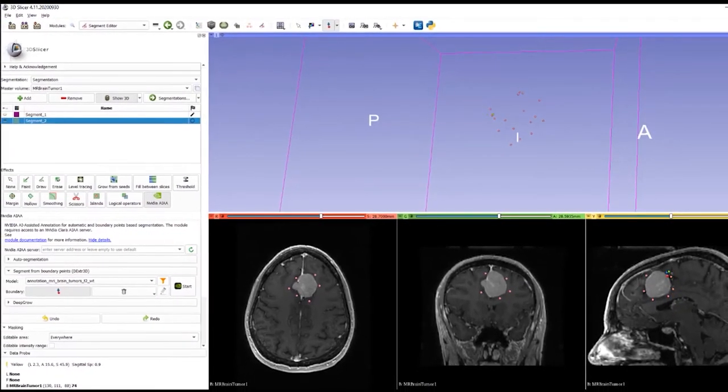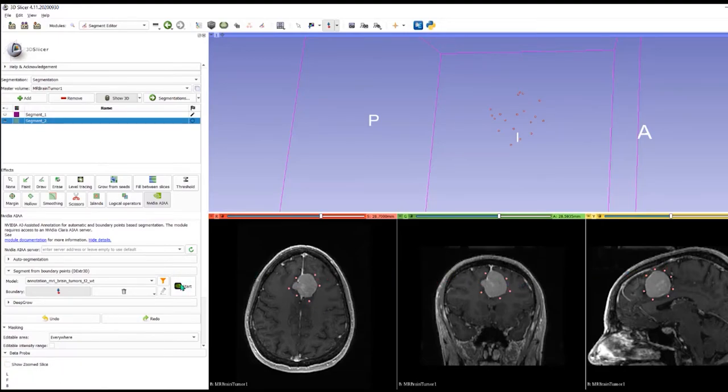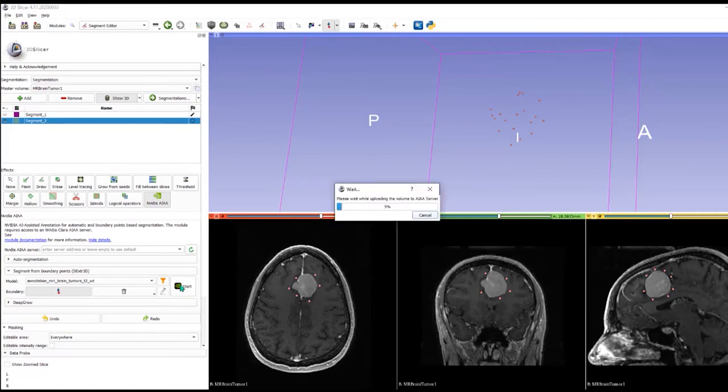The algorithm would be trained with lots and lots of images like this. Once I've got some outline points I will then select start and it'll process.